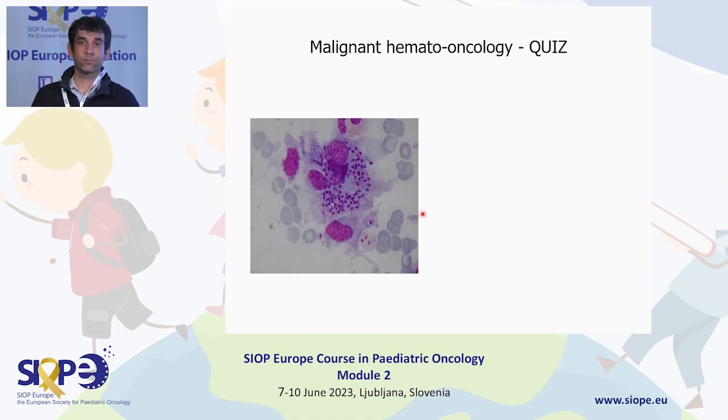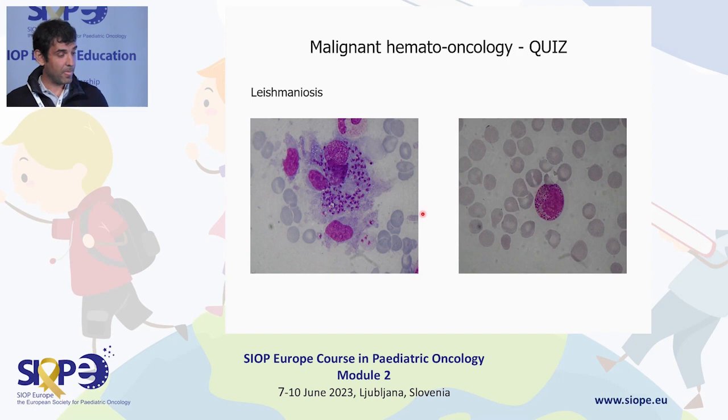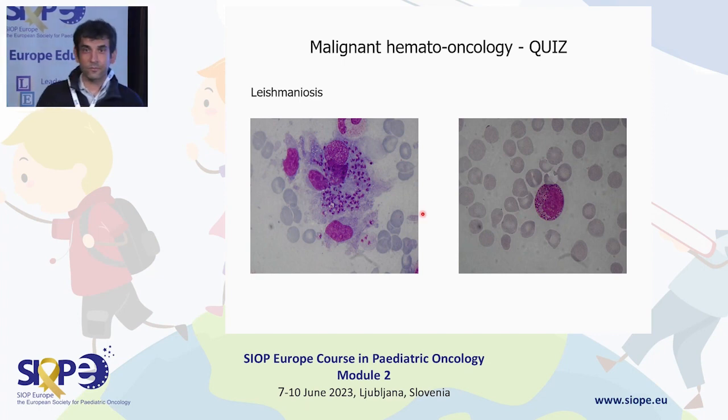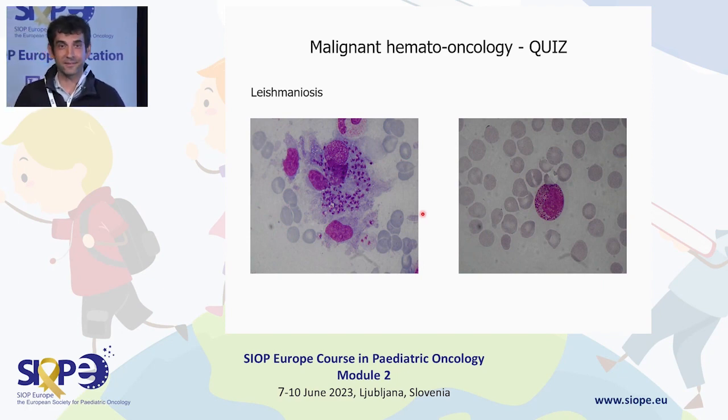Okay, what's this? Yeah, this is leishmaniasis and can cause really life-threatening HLH. These patients can be very ill, so it's rare. What's this? This patient has an immunodeficiency and a pathological appearance of his skin and eyes.